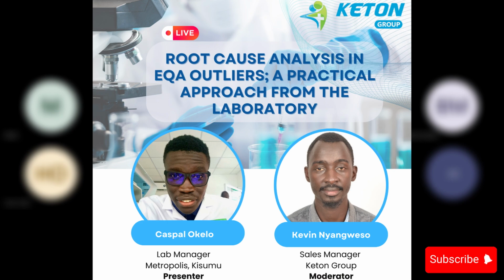So if you recalibrate your analyzer immediately after EQA failure, that's a corrective action. And corrective action will eliminate the root cause of the detected nonconformity. So it will eliminate the fact that this thing was biased. But preventive action, on the other hand, addresses the system. It eliminates the causes of a potential future nonconformity. Preventive action is more of a proactive approach to EQA outlier troubleshooting and addressing.